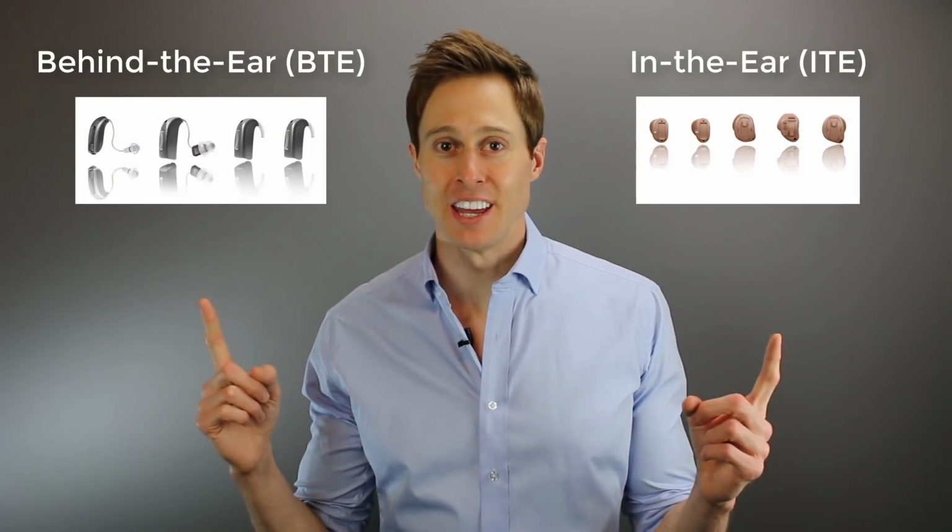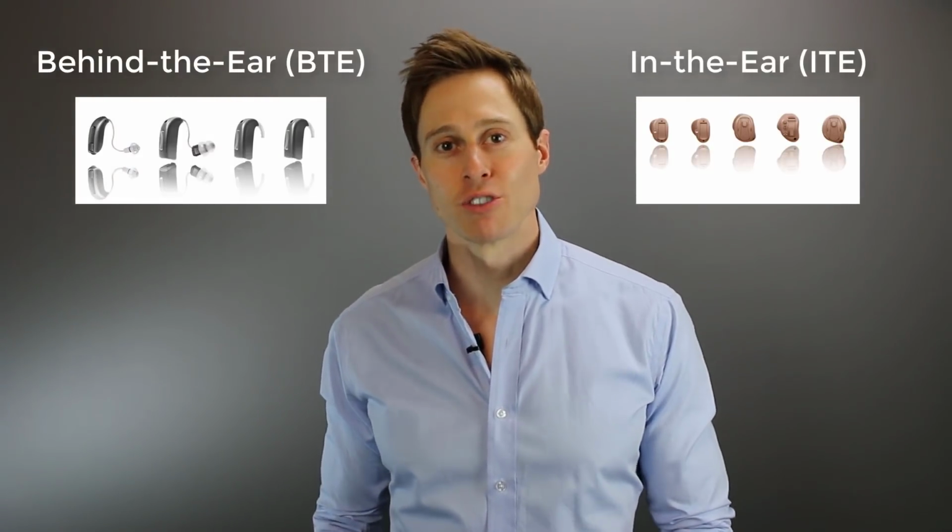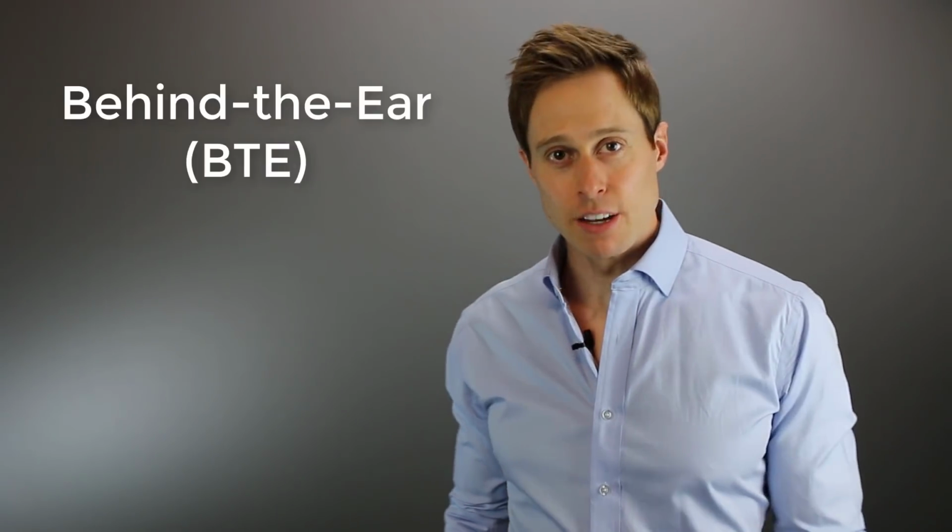There are two general types of hearing aids, behind the ear and in the ear. Now within these two general types, there are several different styles. In this video, I won't be covering those specific styles in detail, it will be more of a general overview. You'll be able to see other videos that I've made on those specific styles if you want. Let's talk about behind the ear styles first.